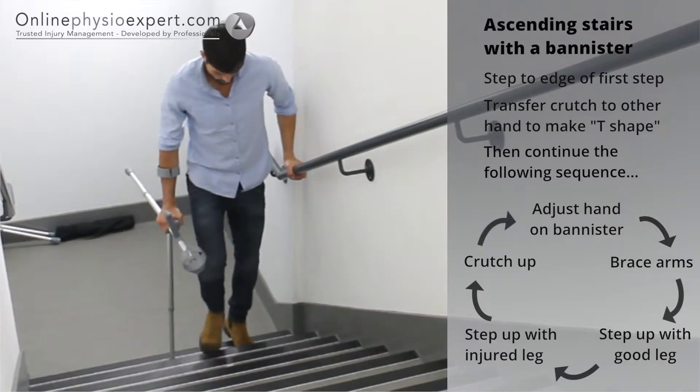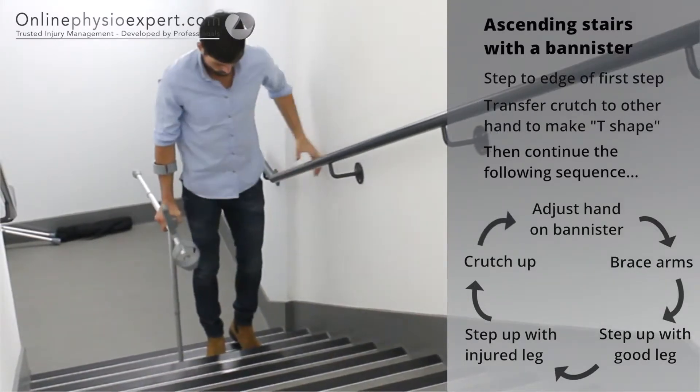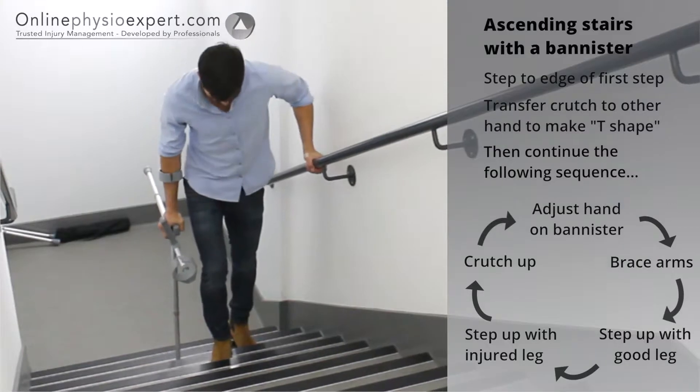Bring the crutch up last. Repeat these sequence of movements until you safely reach the landing.